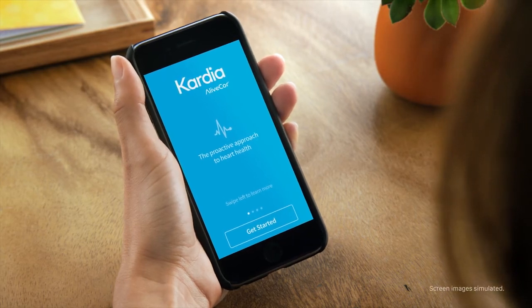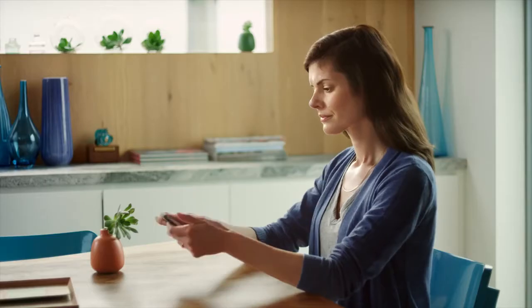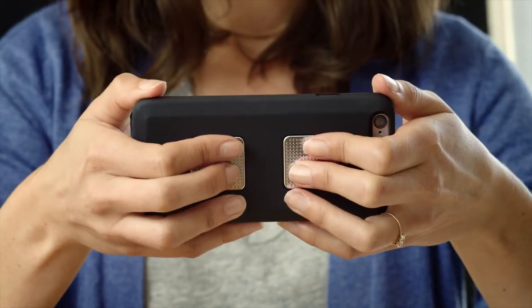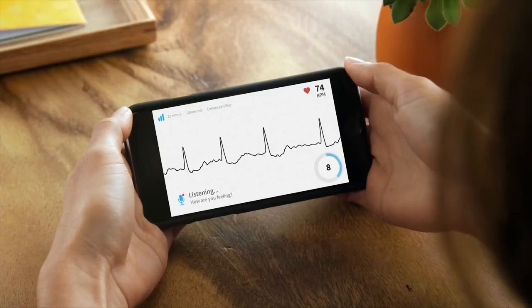This is Cardia, the proactive approach to heart health. Cardia makes it easy to give yourself an accurate, medical-grade electrocardiogram anywhere, so you can track and analyze your heart health without a trip to the doctor.